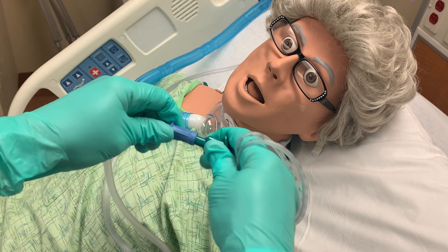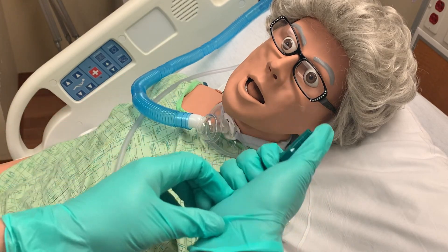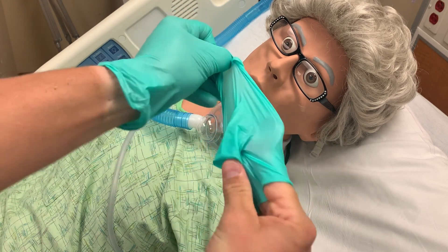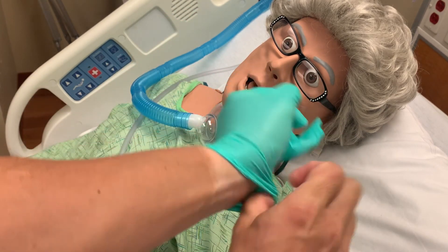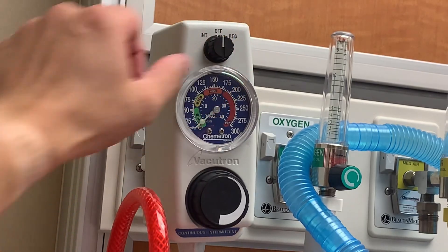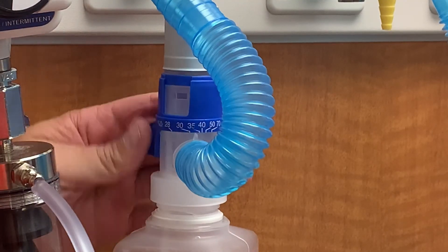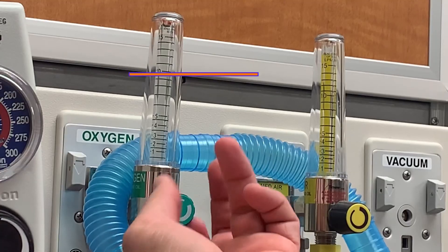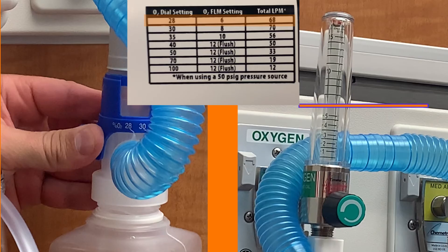One pass with the suction catheter will often be enough to clear secretions, and you will not always need to complete all three attempts. When you have completed the suctioning process, detach the catheter from the suction tubing and ball it into your hand. Remove your glove, which will contain the catheter inside the inverted glove. Hold that glove in your remaining gloved hand and remove the remaining glove, then dispose of the gloves and catheter in the garbage. Turn off the suction and return the patient to their original oxygen delivery setting — make sure to not only rotate the venturi setting, but also adjust the oxygen delivery from the wall unit. In this case, the patient was receiving 28% oxygen requiring 6 liters of O2 from the wall unit.